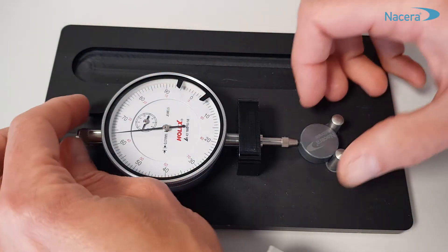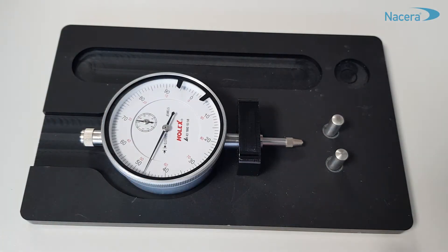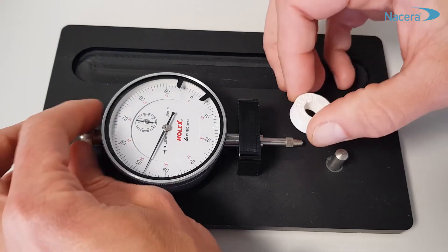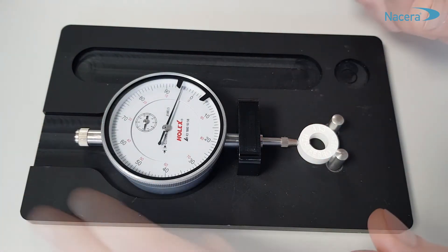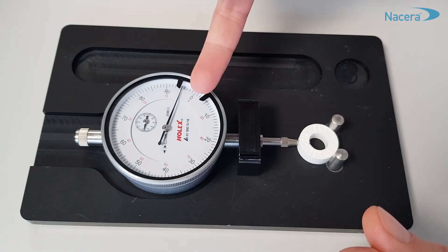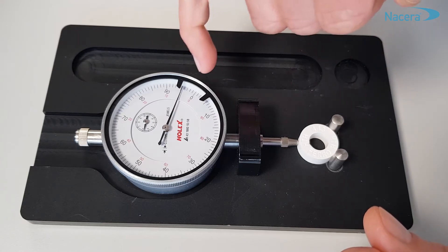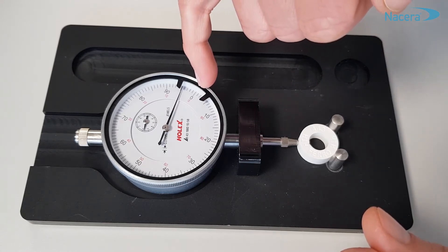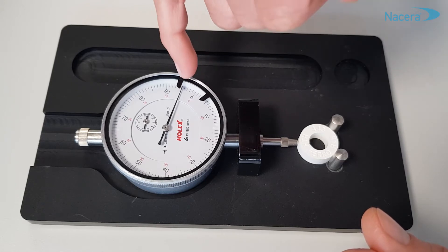Replace now the calibration body by the sintered ring and read the value. Each scale mark corresponds to 2 degrees Celsius, counting from 0 to the left: 2, 4, 6, 8, 10 degrees.